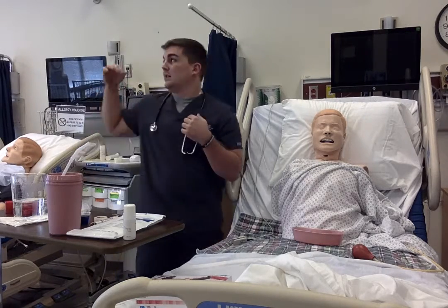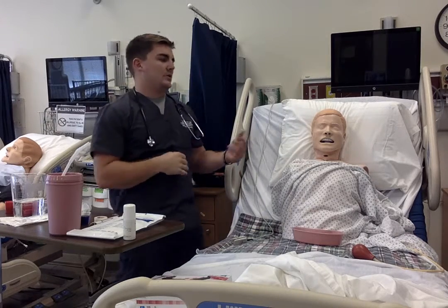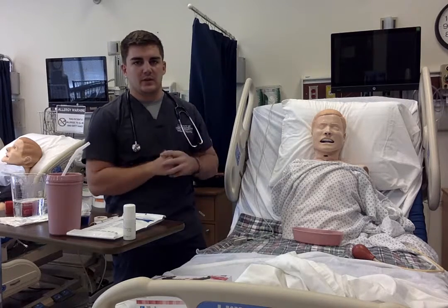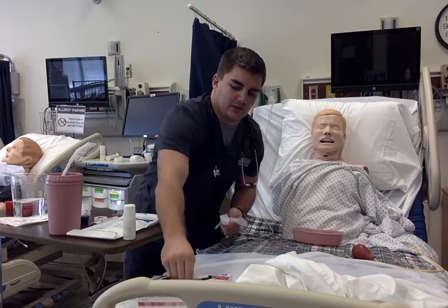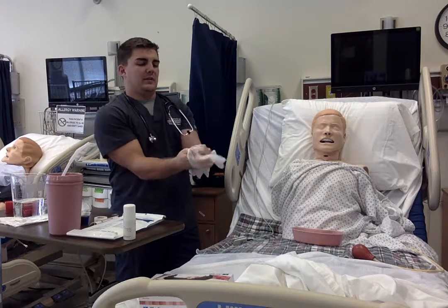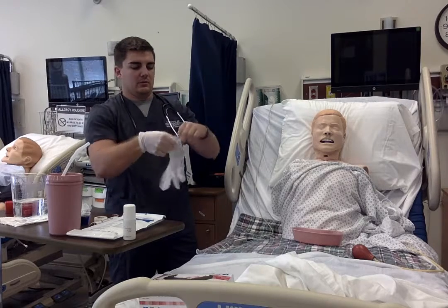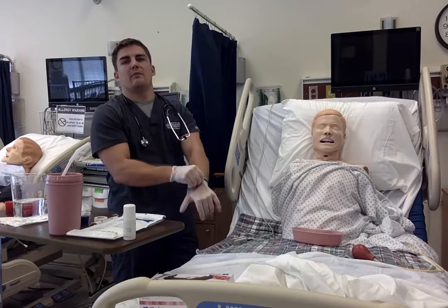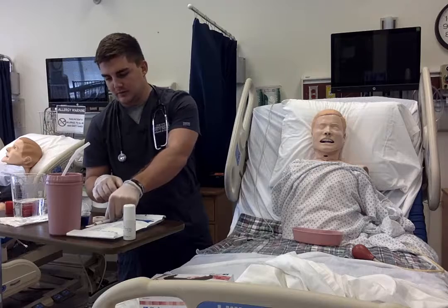To start off the procedure, I would provide patient privacy, introduce myself to the patient, explain to them what's going to happen, get their name and date of birth, as well as follow the orders of the procedure. I would ask them about their history, if they've had any nasal history like a deviated septum or certain symptoms that could affect the tube going down into the nares, into the gastric area.